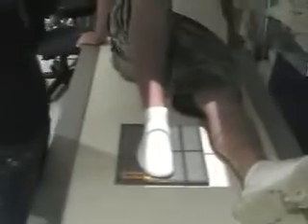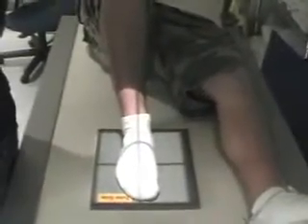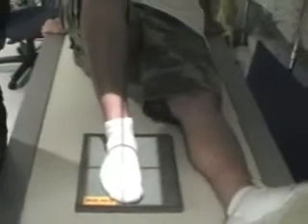Make sure that... Table time. You've got to line it up to the base of the third metatarsal. Are you pregnant? Thanks for the introduction. Could you be pregnant? Maybe.